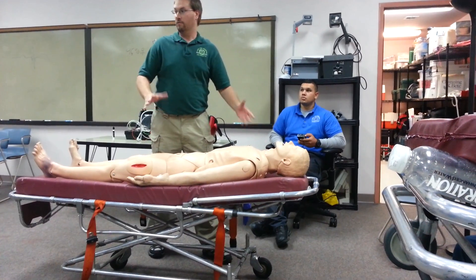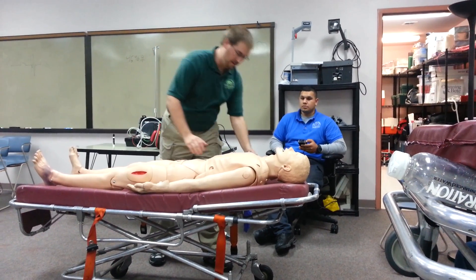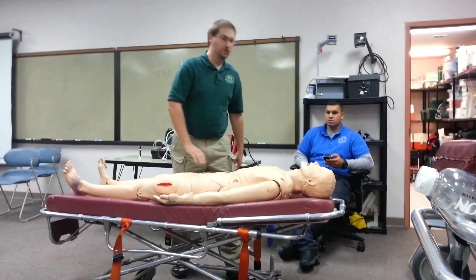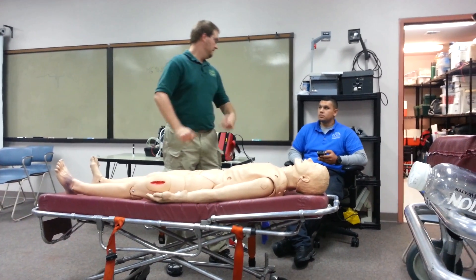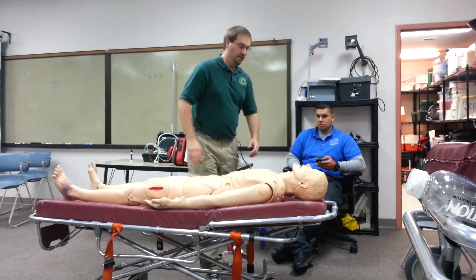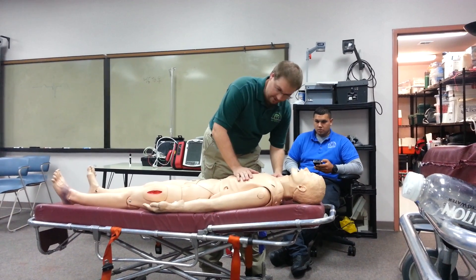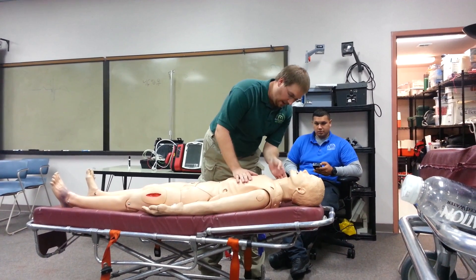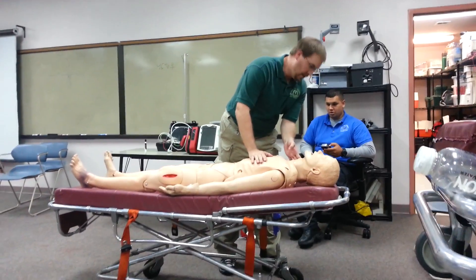I'm going to check for a level of responsiveness. 'Hey ma'am, can you hear me? What's going on?' No response. I do have people here to help me. At this time, I'm going to open and check the airway. Is there spontaneous breathing? No breathing. I'm going to check for a pulse. No pulse.